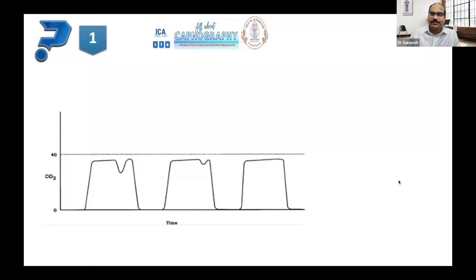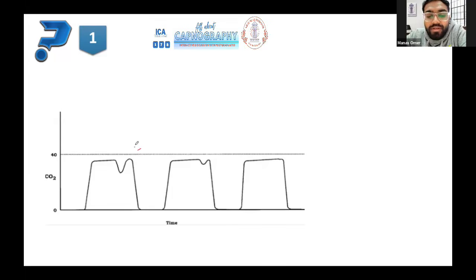So it's a curare notch. It shows spontaneous ventilation. One third of the expiratory phase shows spontaneous respiration, and then it goes back to the normal waveform. Either we have given a muscle relaxant, or it may not be very consistent, because spontaneous attempts may be at a lower rate when the patient is about to come out of the neuromuscular blockade.